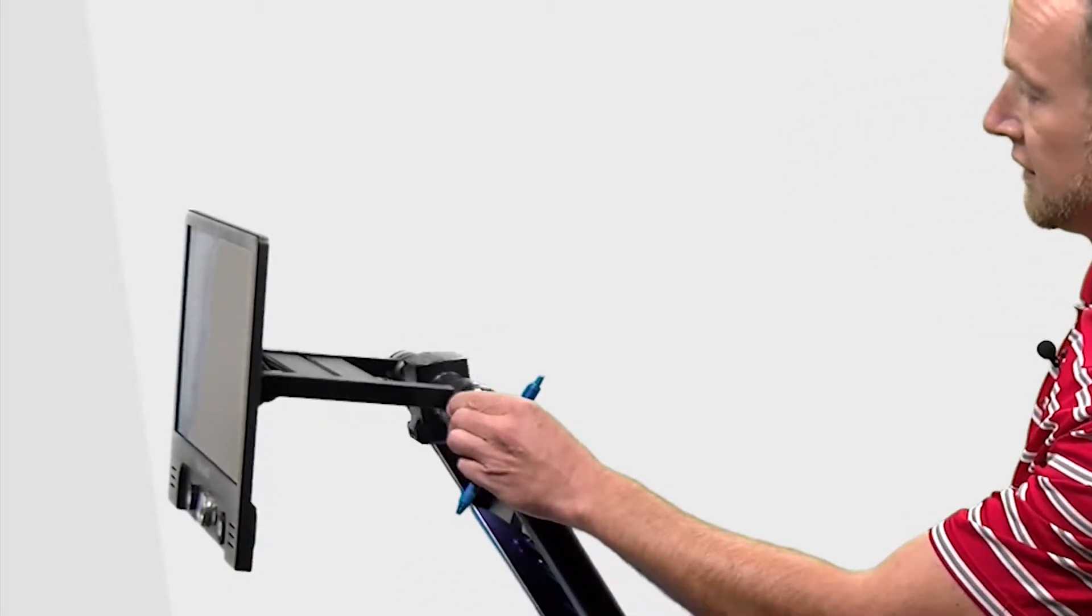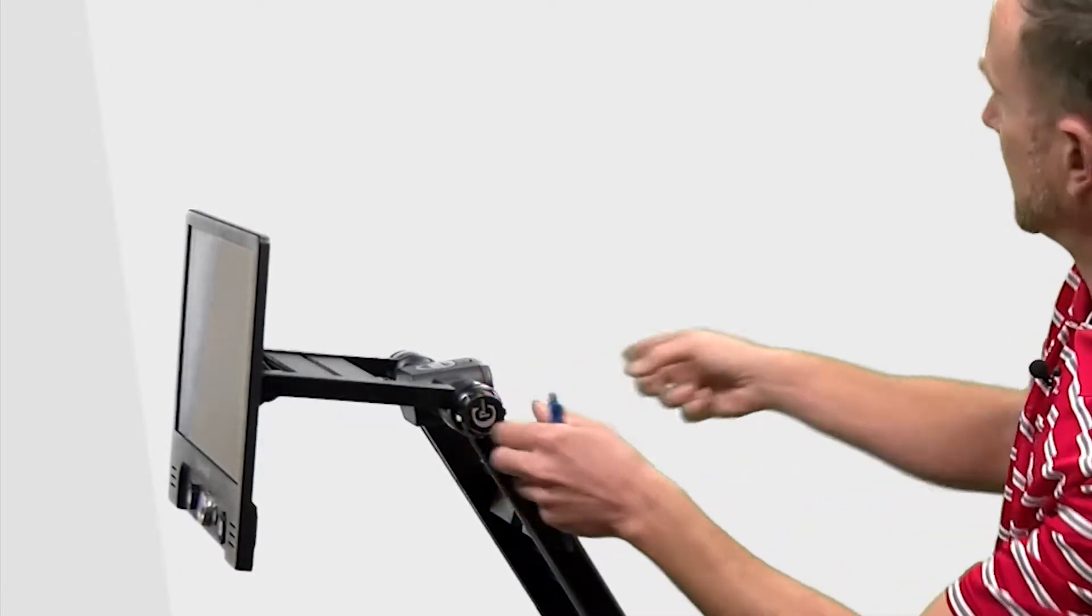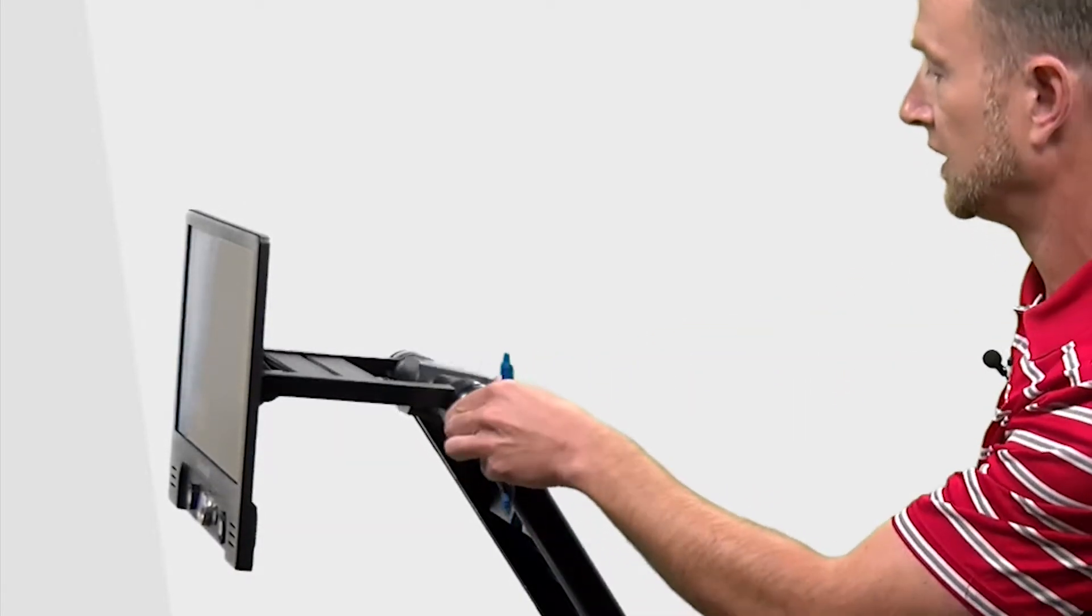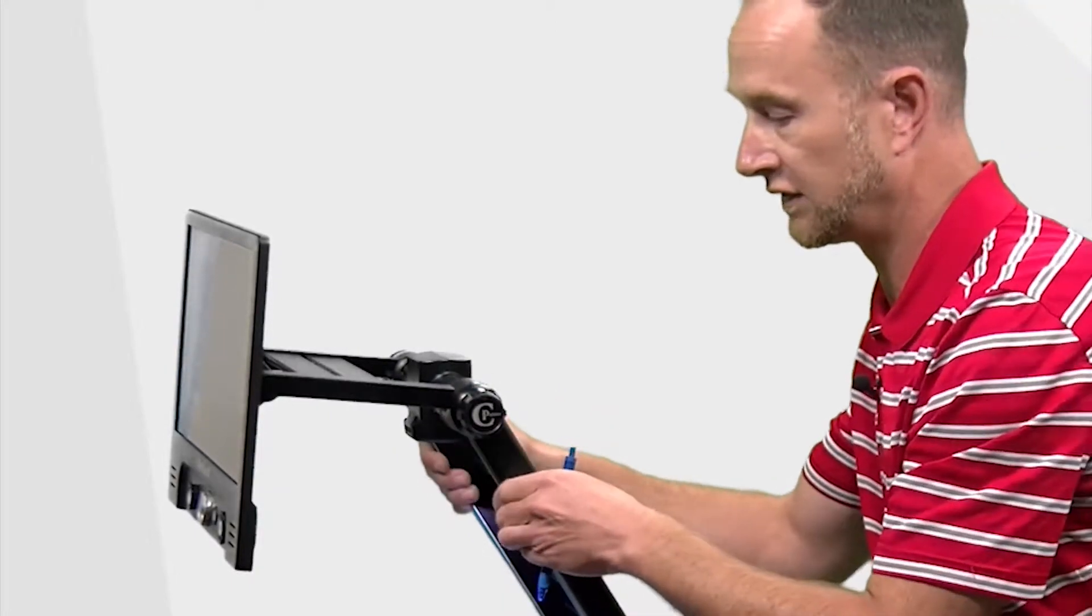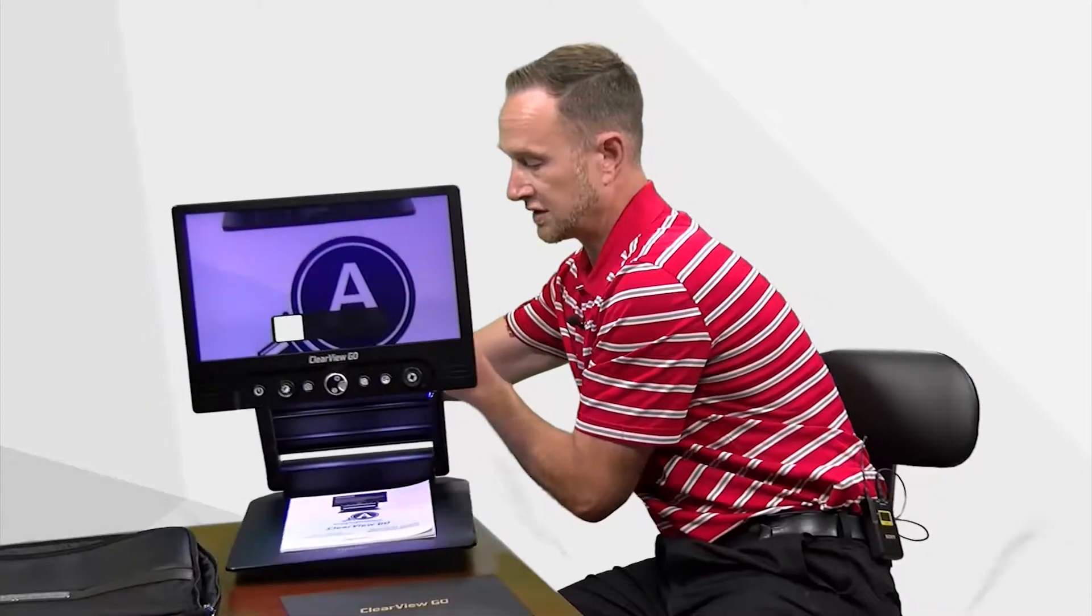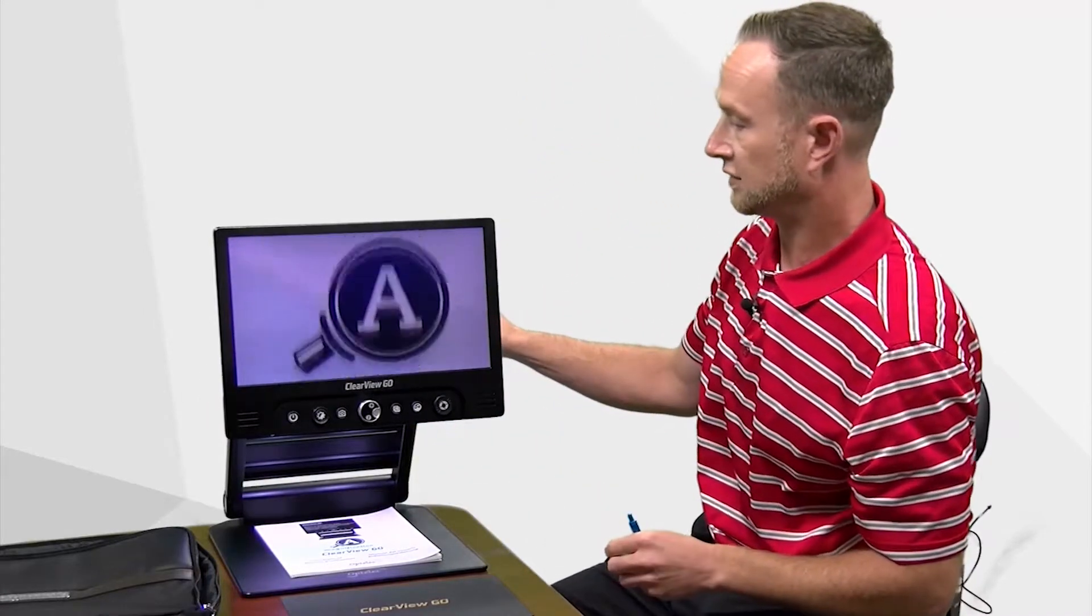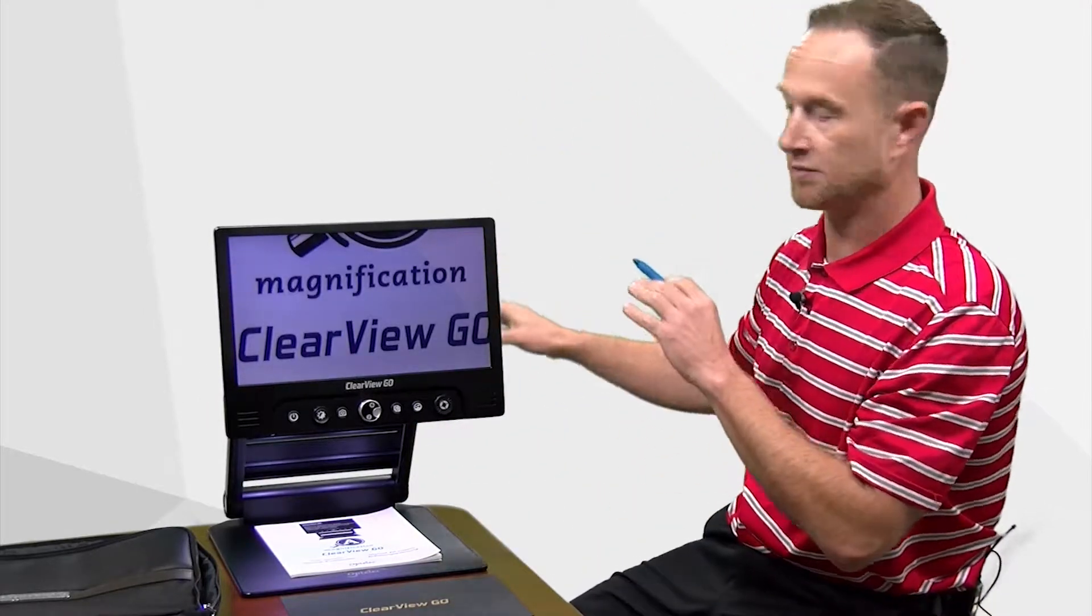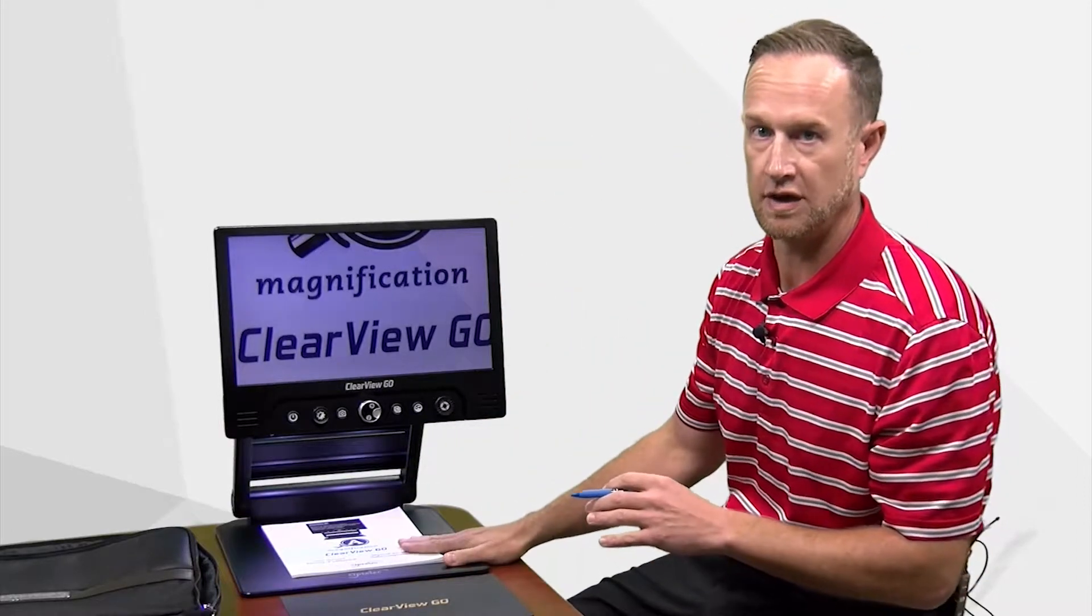Furthermore you can then extend this all the way out to do some distance magnification. That's particularly important in school settings. So if a student is sitting down watching the teacher they can easily rotate this camera up and watch the entire presentation and then rotate the camera back down to do all of the desktop work.